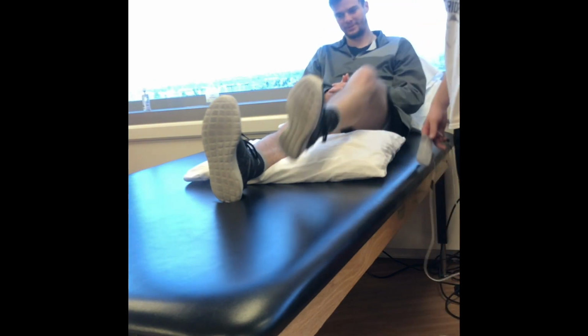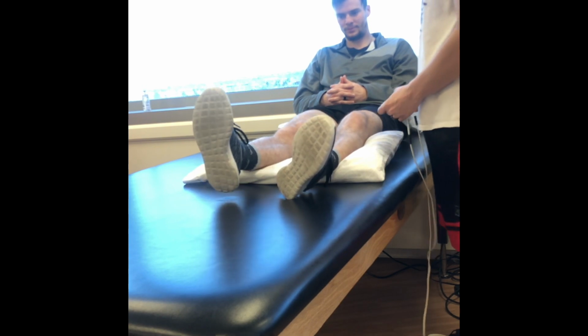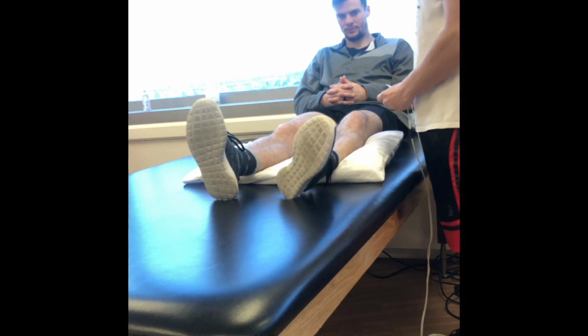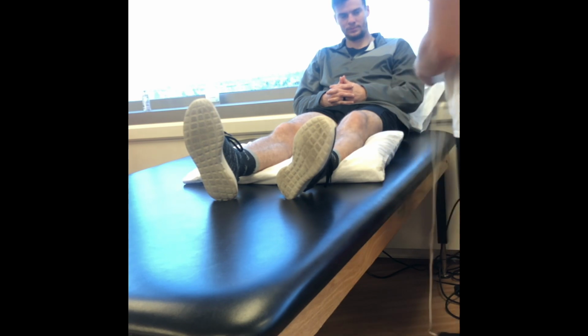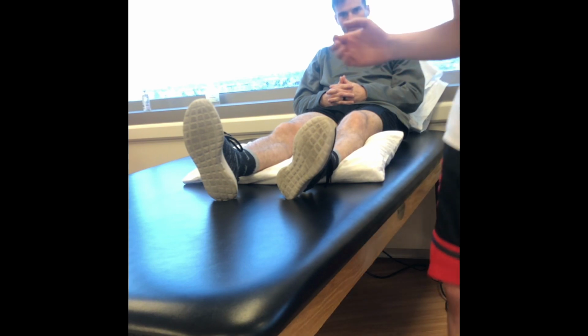And then after the treatment, you just want to check and make sure. Sometimes people can be a little sensitive to the adhesive. I don't see any red spots or blisters or anything, so I think we're all set to go. So I will go ahead and get this put away. And that is biphasic current.